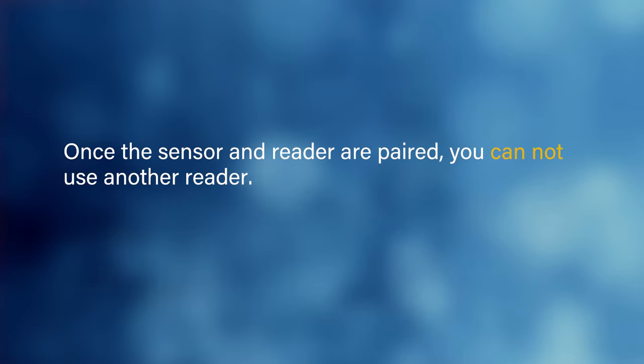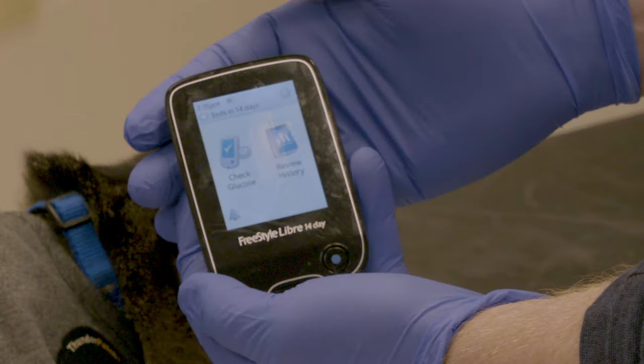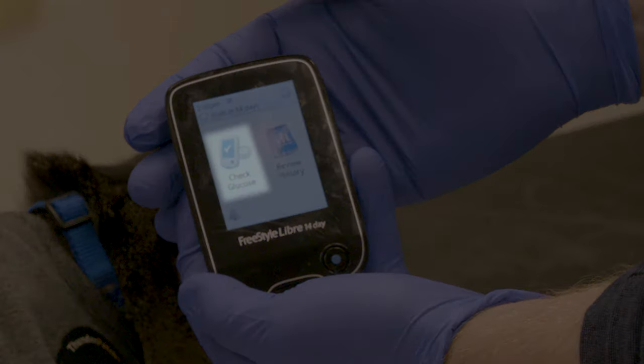Once the sensor and reader are paired together, you cannot use another reader. So make sure you have a dedicated reader prior to starting the device. If the prior sensor had not expired prior to removal, you may need to use the check glucose setting first in order for the reader to detect that a new sensor has been applied.